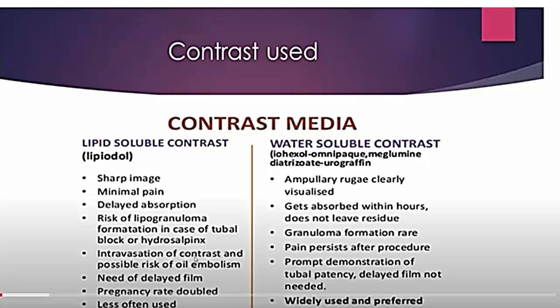Intravasation of contrast with possible risk of oil embolism was a problem. But here the intravasation is not so dramatic because it is just excreted by the kidney, and there is no risk of oil embolism.